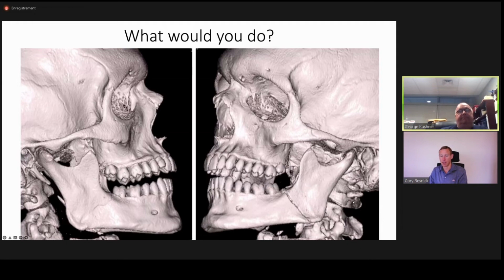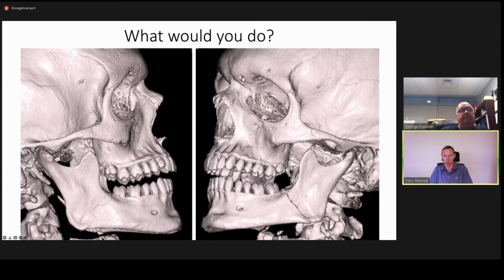Yeah, great question. Not sure there's a universal answer to this. I'll just tell you my preference, but I think there are variations that would work quite well. My preference is to place the intermaxillary fixation appliances as the first step, not necessarily actually place the patient in IMF. But let's say I'm using a set of Erich arch bars, for example, or a combination, like I mentioned, I often do, of a hybrid arch bar on one arch and an Erich arch bar on the other. I will place those arch bars as the first step in the procedure, typically. But I may not apply the intermaxillary fixation to those arch bars. So typically I'd have my set of arch bars in place. Then I would expose all of my fractures. And then I would start to place the MMF on that set of arch bars as I get the fracture reduction and fixation going. That's my preference.